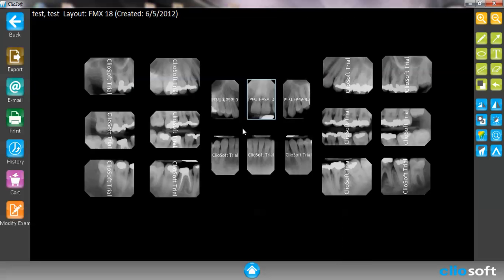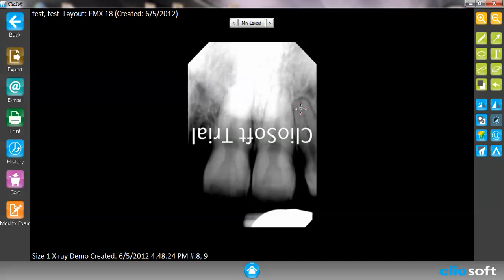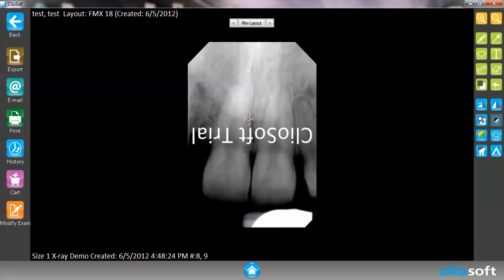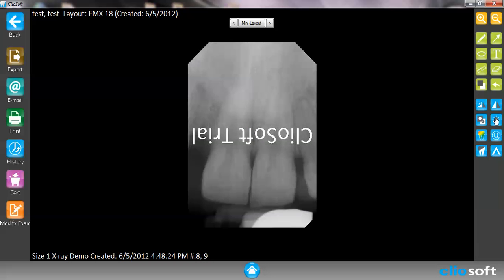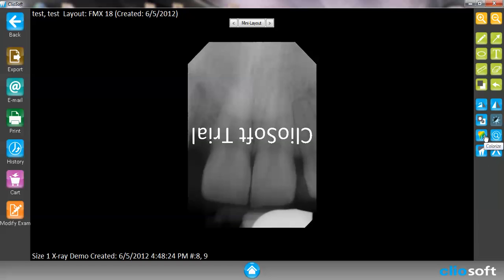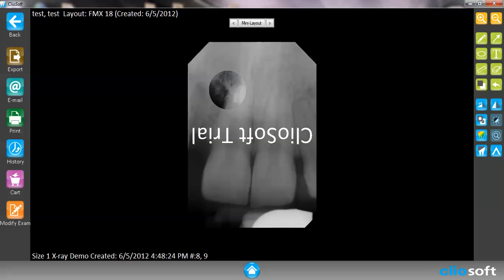So let's go ahead and take a look at our sensor images. We can use the same tools, but the sensor actually has a few more options. For example, we can drag our mouse left and right to change the contrast, and go up and down to change the brightness. We can auto-adjust, flip the negative, and colorize it. We can also use the magnifying glass.